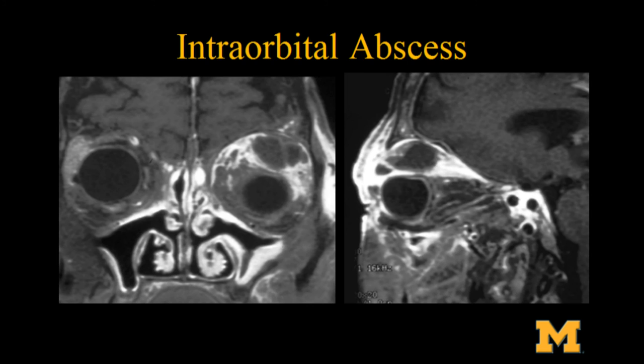So here's an intraorbital abscess here. On the T1 post-gadolinium with fat suppression, we can see this diffuse enhancement extending behind the orbit. So this is obviously a true surgical emergency.